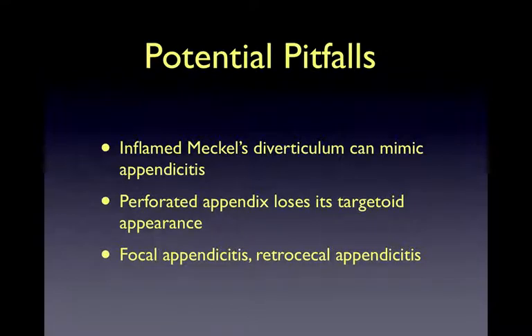Inflamed Meckel's diverticulum can mimic appendicitis. Perforated appendix can lose its targetoid appearance. Focal appendicitis and retrocecal appendicitis can be difficult to pick up. Most important of all, failure to visualize the appendix on bedside ultrasound does not and should not rule out appendicitis.